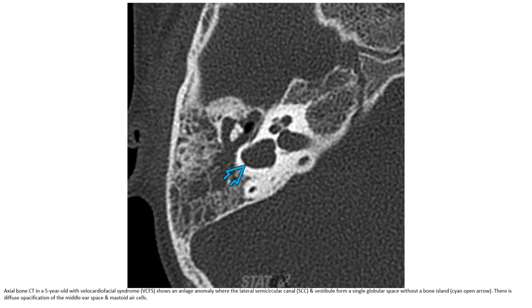The lateral semicircular canal and vestibule form a single globular space without a bony island, with diffuse opacification of the middle ear space and mastoid air cells.